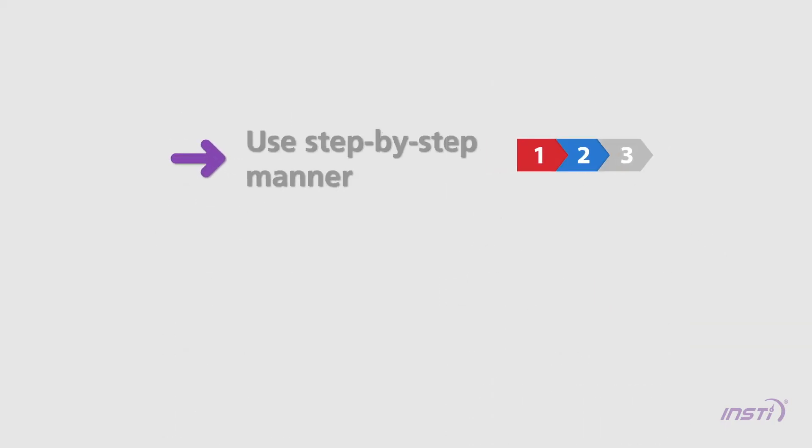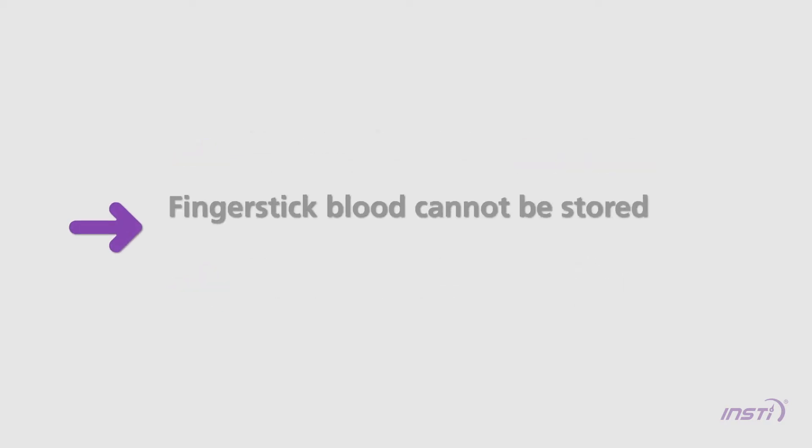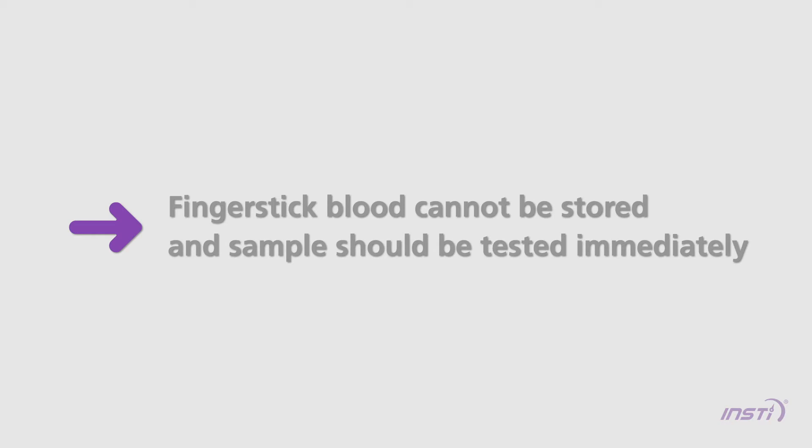INSTE is intended to be used in a step-by-step manner with no pauses or breaks during the testing process. Whole blood specimens collected by finger stick should be tested immediately.